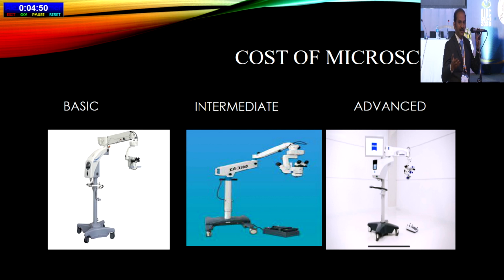So a friend who is a very good mentor who's 45, his experience will be different from a pre-presbyope. So you need to really experience it, never go just by the words. You need to operate 3 sessions. And regarding the stereopsis, once you start using it, definitely you'll get adapted to it. Definitely there will be a loss, so one advantage will come with another disadvantage, but the neural adaptation will definitely help you in the long run. So all that matters is your experience with that particular device.